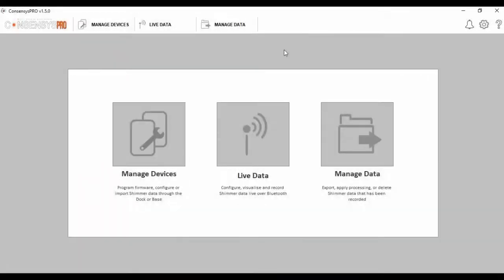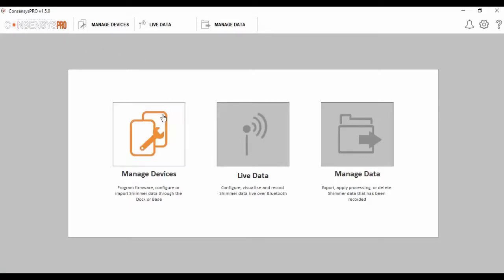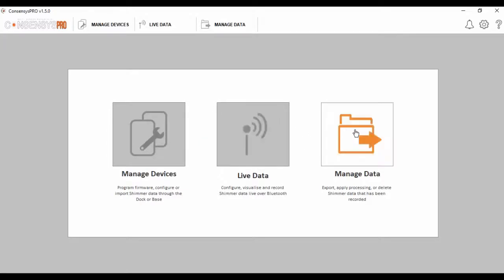We are now going to focus our attention on our Consensus software application. For the purposes of this exercise, I am using the Consensus Pro version of this software. When you start the application, you are presented with three core tabs: Manage Devices, Live Data and Manage Data. I will explain the function of each tab in this video.